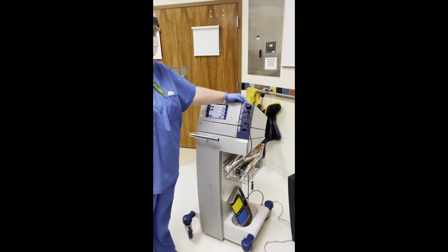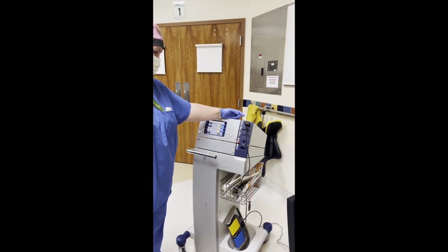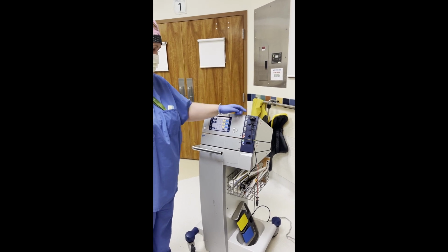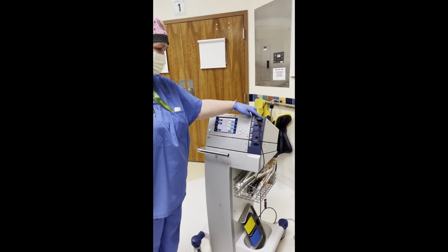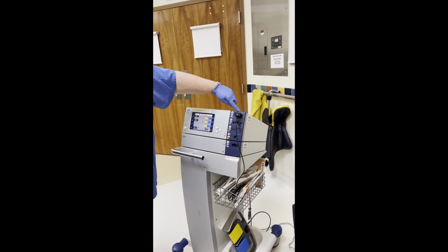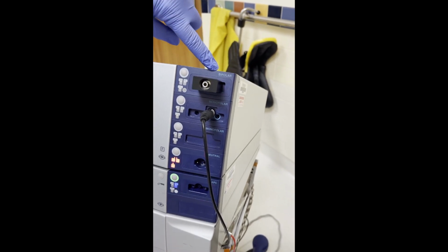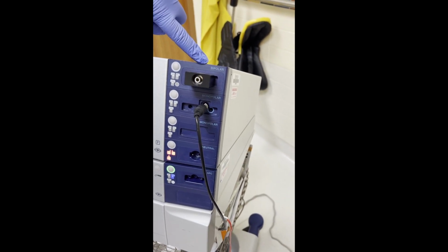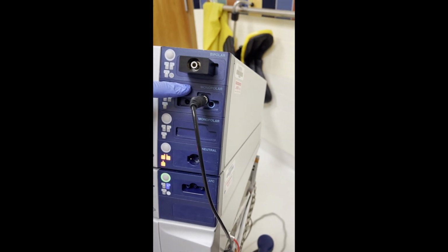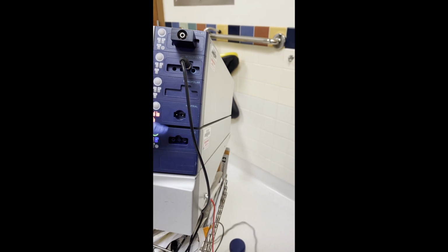Up here is bipolar, and we're going to talk about the cautery gold probe specifically. That is bipolar. You do not need to ground. If you look a little closer, this is a dark blue base. Right here on the top, you'll see a lighter blue that says bipolar. This one here says monopolar, and then monopolar neutral and so on.